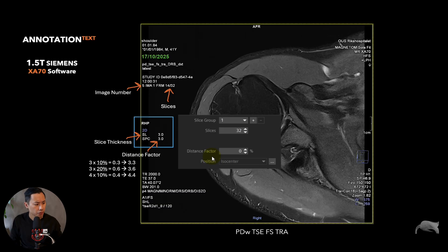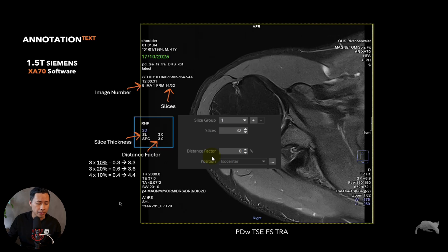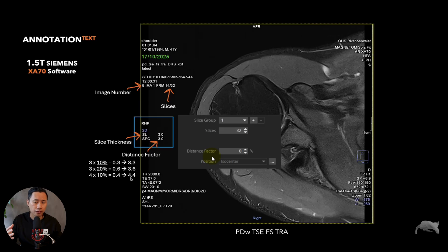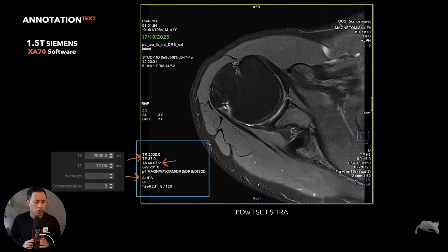That means you know there is some distance factor used in this sequence. If you use 20 percent it would be 0.6, so 3 plus 0.6 is 3.6. And if you use 4 millimeter slices with 10%, it would say 4.4. That's how it gives you a clue whether a distance factor is being used or not.